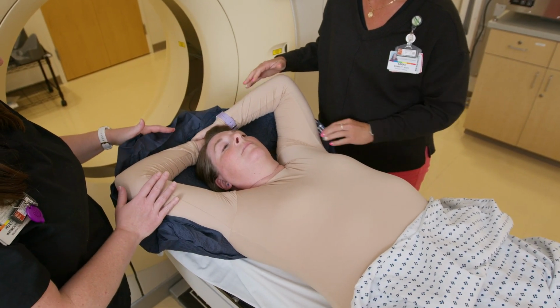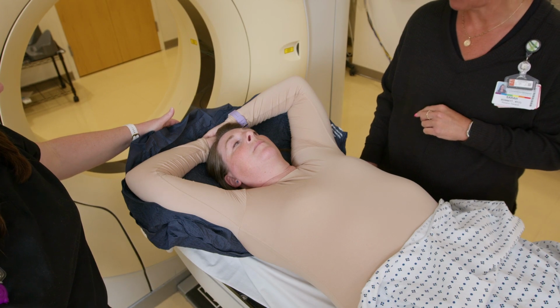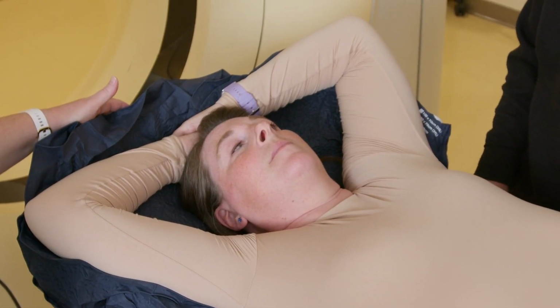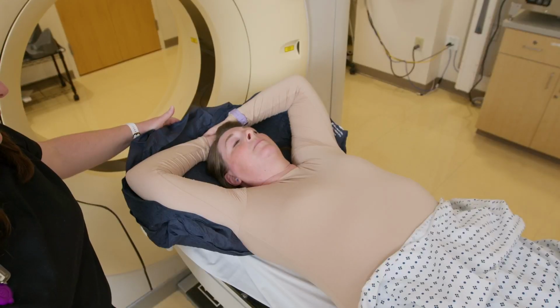Your arms will be supported above your head in the mold. This is the position you'll be treated in daily, so we want you to be as comfortable as the position allows. Please let the therapist know if something does not feel comfortable. They're happy to help you get into the best reproducible position. Try to relax your muscles, especially your shoulders.